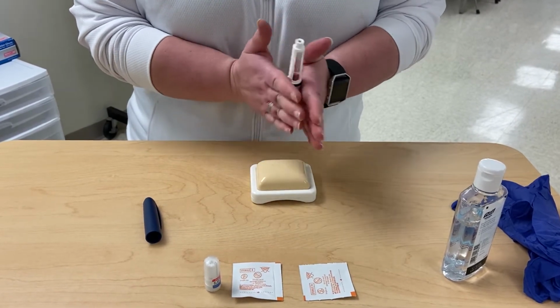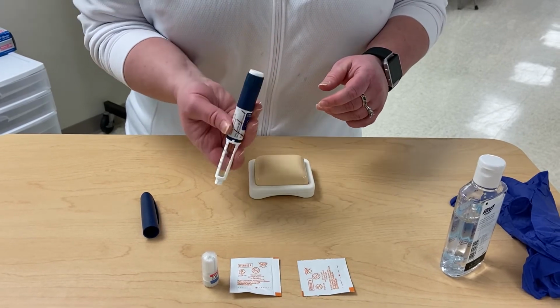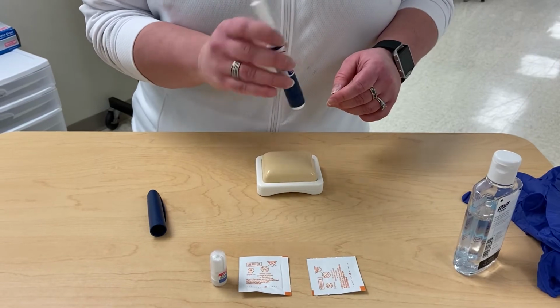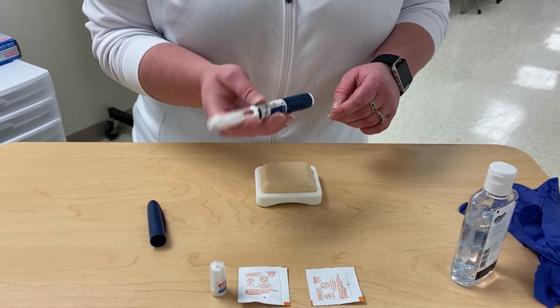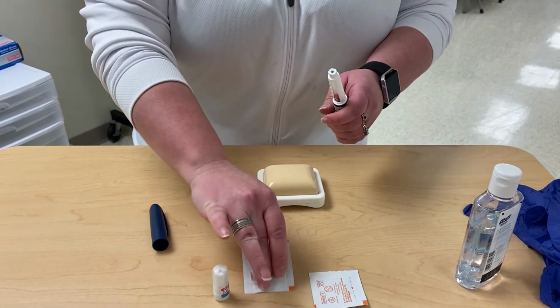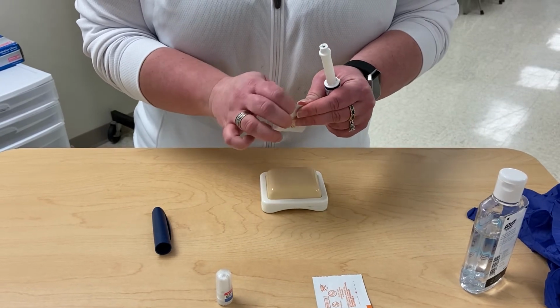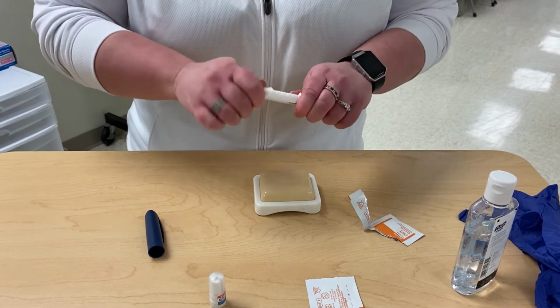And then we are going to invert 10 times to properly mix the insulin. Next, we're going to take an alcohol swab, and we are going to scrub the hub for 15 seconds.